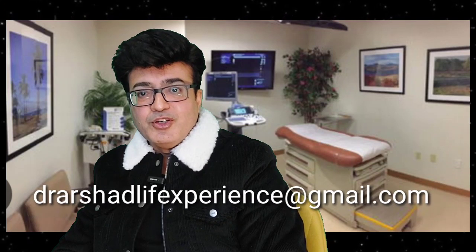Yes, friends, this was all about the liver cysts, congenital liver cysts. We discussed the simple cyst, the biliary cyst, autosomal dominant polycystic disease, and also biliary hamartoma. So I hope this will be a very helpful video for you.